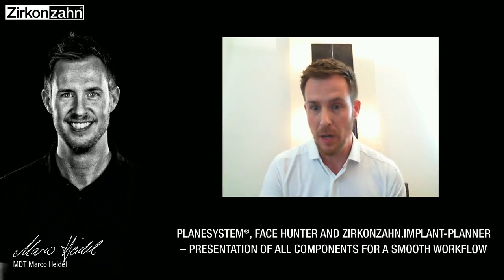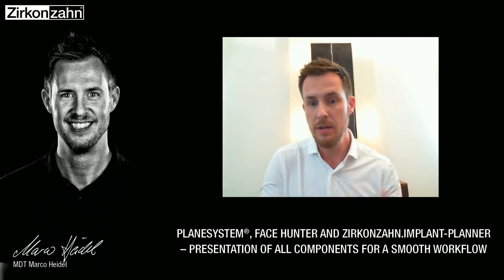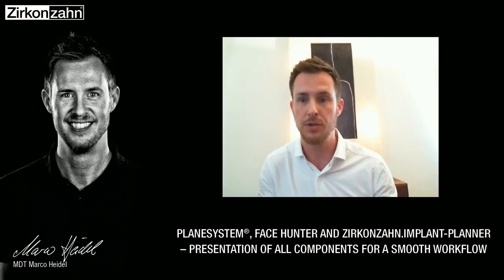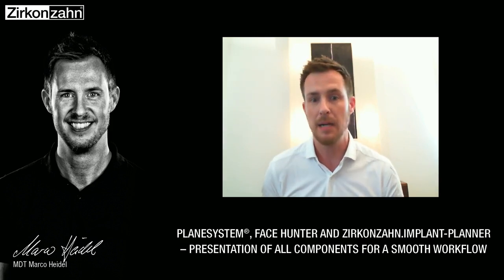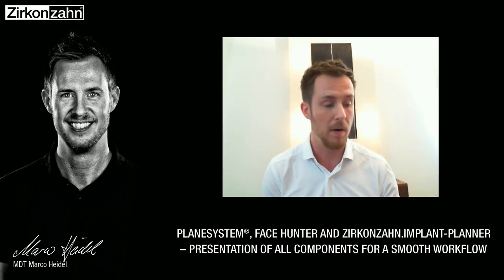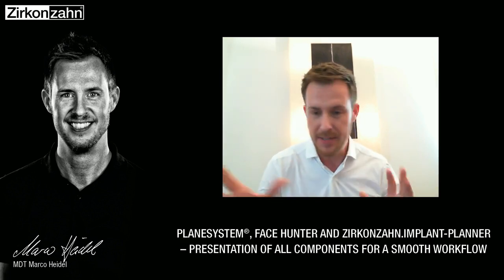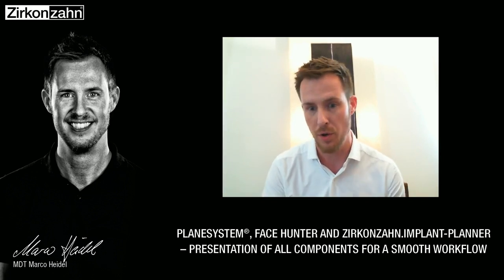Well, those are different steps you can also leave out of this whole workflow. It's up to you. You're really flexible. You can work also part analog and digital. It's a very open, very flexible system to work with.